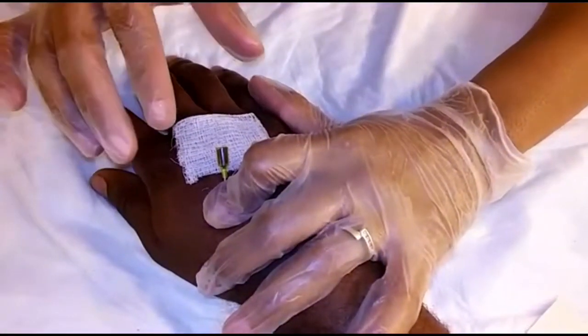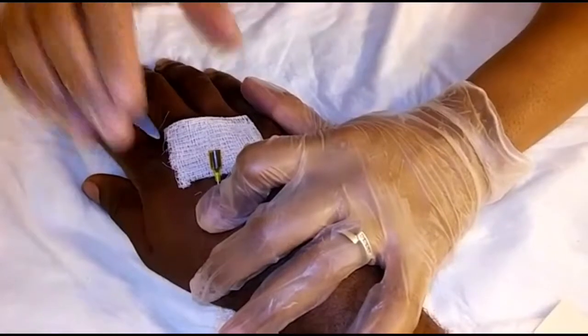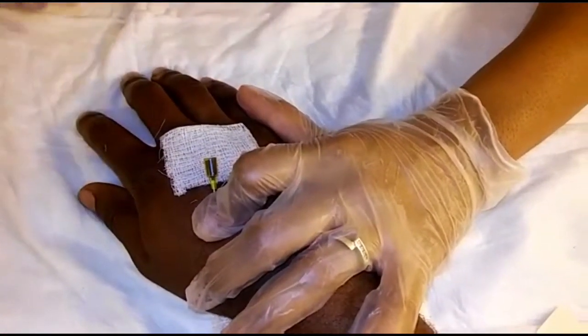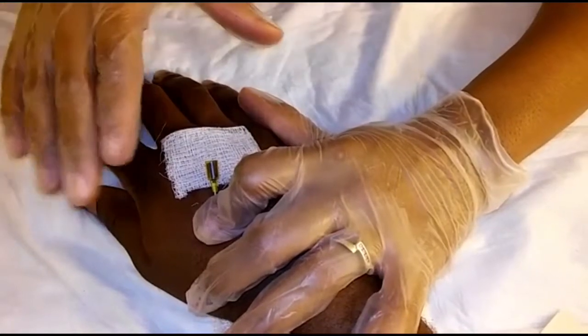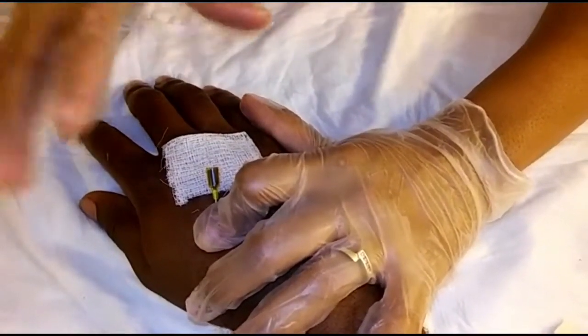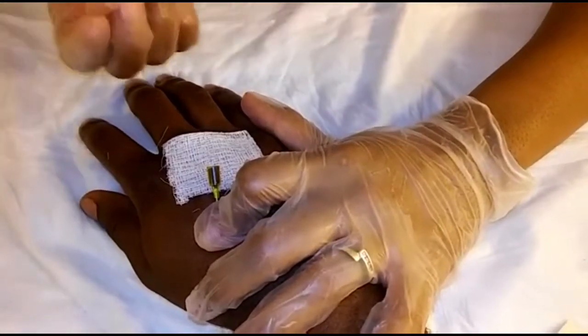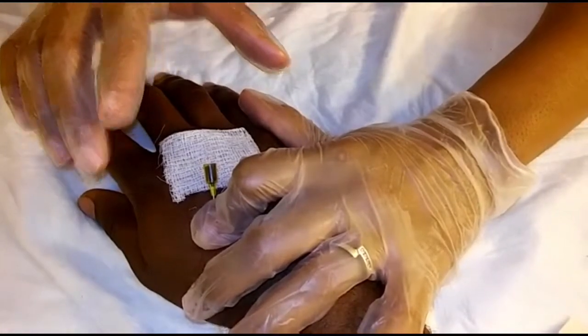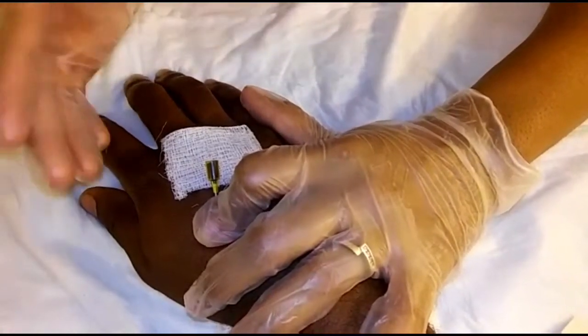The flash indicates that the bevel of the needle has entered the vein. I lowered the catheter into the vein, advanced it about a quarter inch, then stabilized the needle and advanced the catheter off of the needle until I just have the catheter remaining.